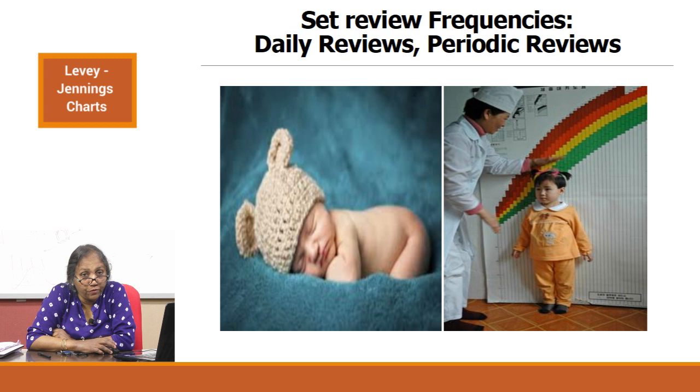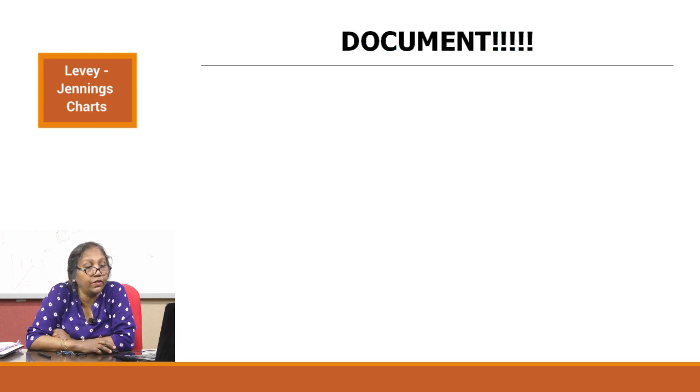Again, there are multiple ways of looking at your chart. There could be daily reviews. In a newborn baby, just a pictorial example I'm putting, you may want to review the baby daily, but once a toddler, you may want to review at a certain periodicity. In the case of a laboratory, you would want to have your reviews decided as per the performance of the analyte. It's not a blanket decision. Like, the quality manager or the technical manager will review it once a month. No, that's not how it happens. For analytes which are critical and are poorly performing, you might want to review more frequently. For stable analytes, you can review less frequently. We'll talk about these things in the videos which are coming up.